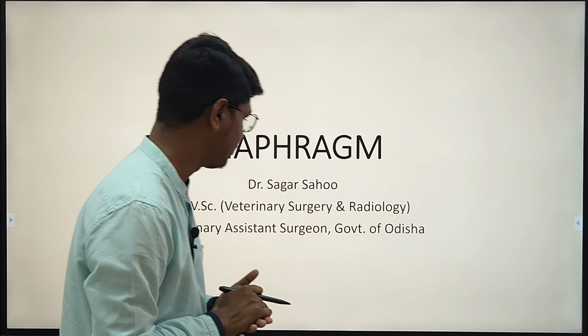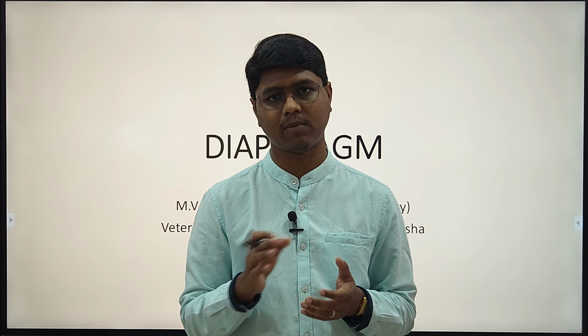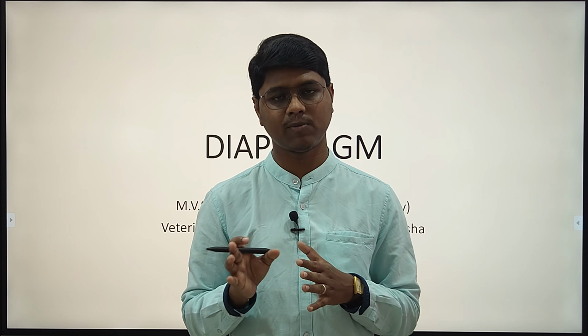Let us go back to our video. So today we will be dealing with the radiography pathology of the diaphragm. As you know, we are doing the radiography pathology of different organs of the abdomen and thorax. I have already completed the abdomen. This is the 12th lecture actually. We are continuing the radiography pathology of the thorax.